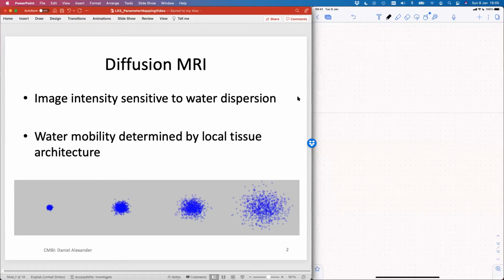If you think of just a glass of water at room temperature or at body temperature, although the water in there looks perfectly still, actually, if you were to look at individual water molecules, they're all moving around quite rapidly. You can see that if you were to put a drop of ink in the center of that glass, and you'd observe that gradually over time, that drop of ink spreads out over the extent of the glass, in a way shown down here.